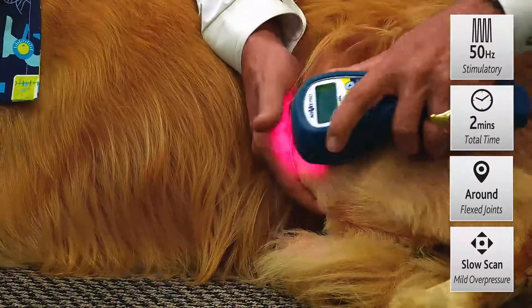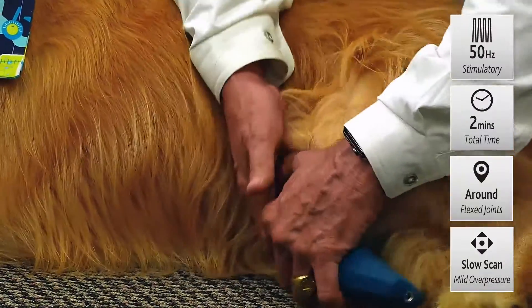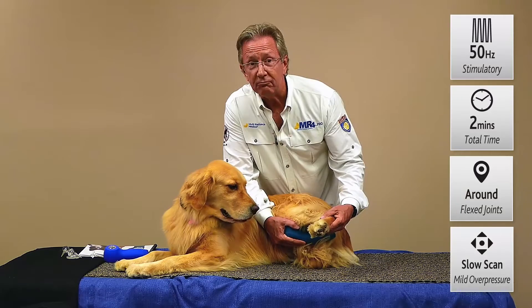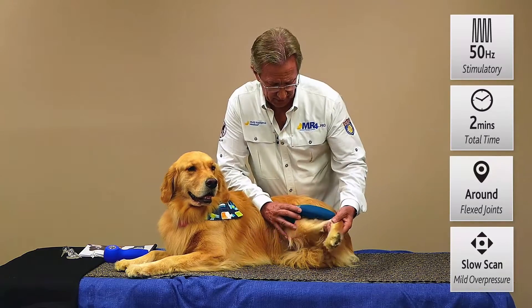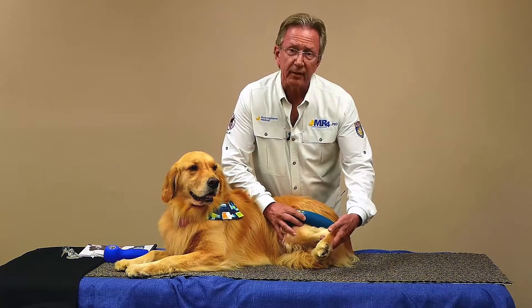Oftentimes we can get them to just roll over a little bit. We'll treat radially around that joint, and then with one arm we'll simply flex the leg a little bit so we can get into those articular surfaces — because it feels so good, tolerance is really beautiful. So we just flex that joint, get inside those surfaces where the inflammation lives, treating radially around each joint and repeat on the other side.